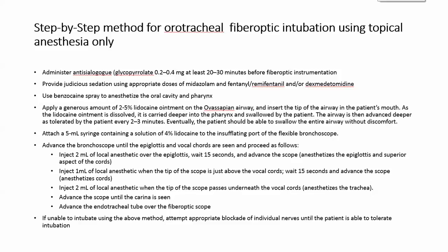Benzocaine spray is used to anesthetize the oral cavity and the posterior pharynx. 2 to 5% lidocaine ointment is applied on the Ovassapian airway and inserted, and the tip of the airway is inserted into the patient's mouth.